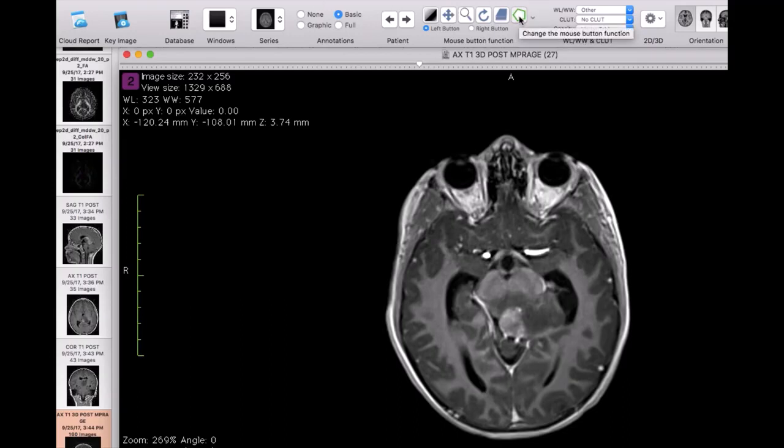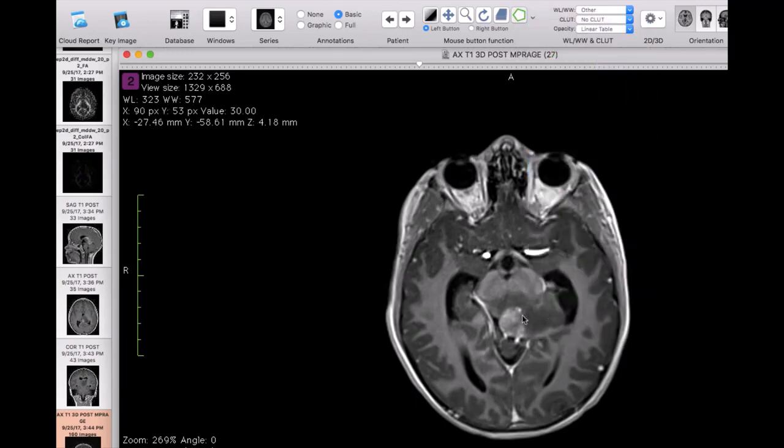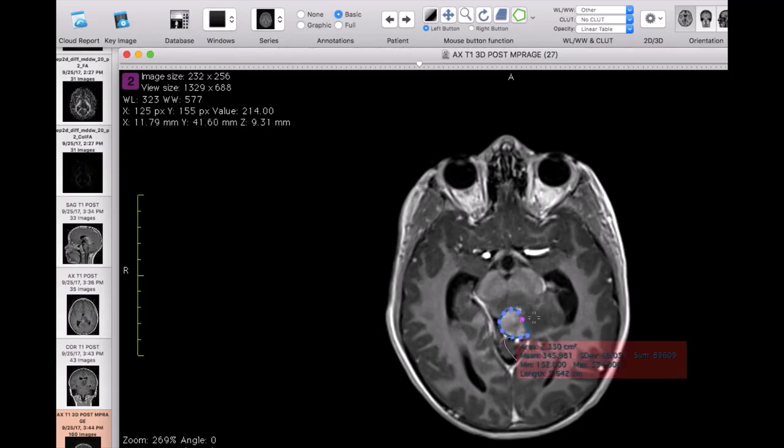Right-click on the ROI or region of interest drop-down tool and select close polygon. This will allow you to place ROI points circumferentially around the tumor. Repeat this step throughout the entire image series until nearly all slices have an outlined ROI.